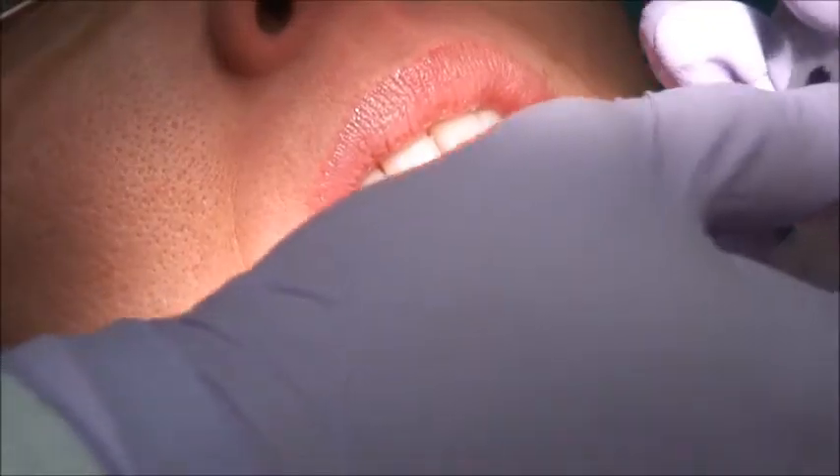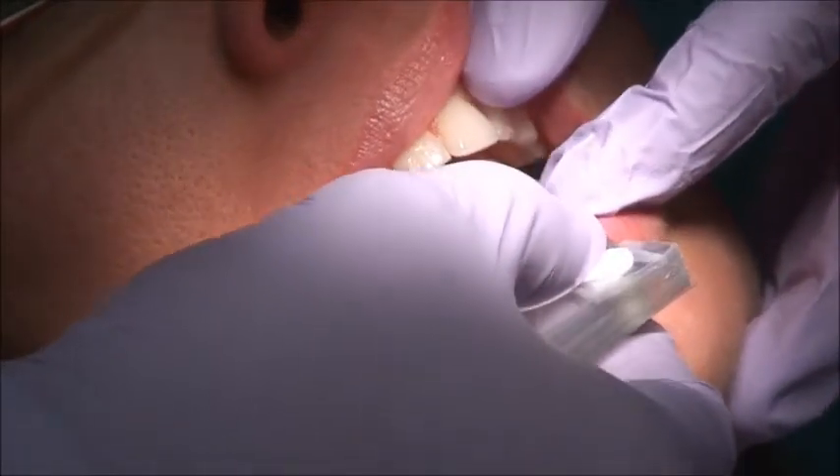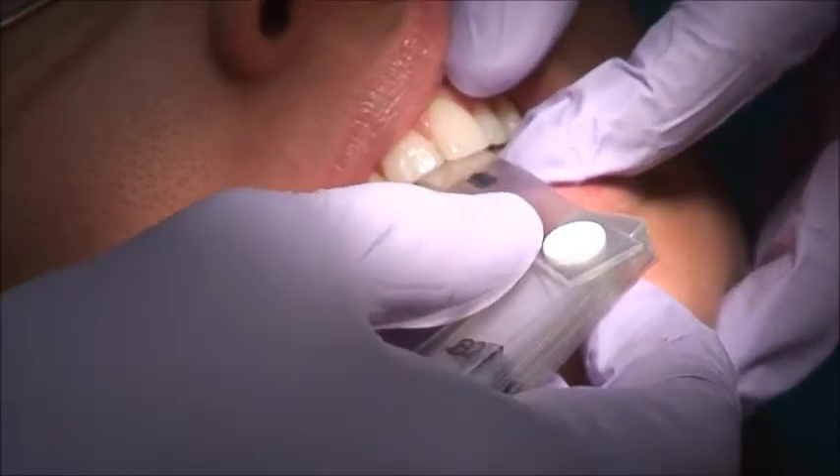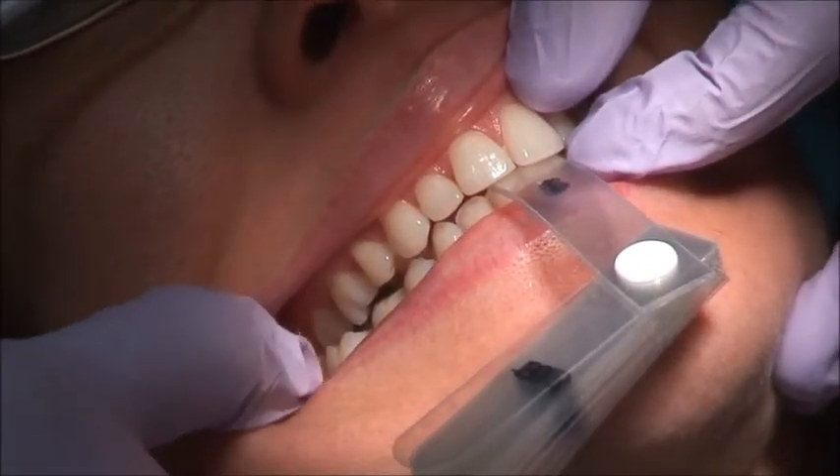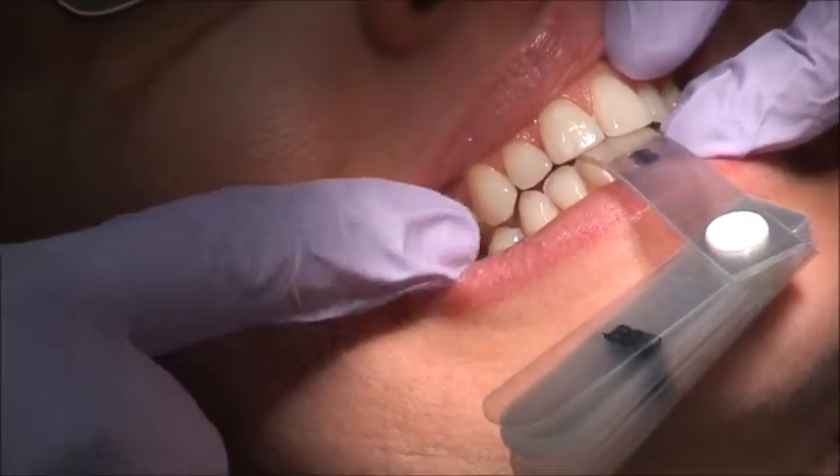Now down to eight sleeves. Forward back squeeze — do you feel anything touching? Not yet. Good. It looks good, it's almost touching.